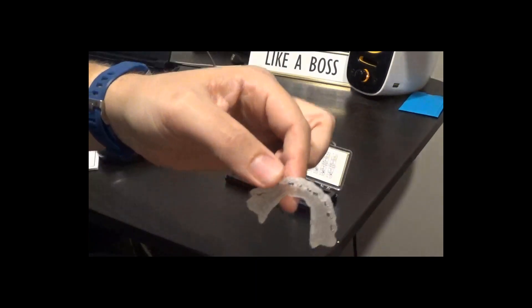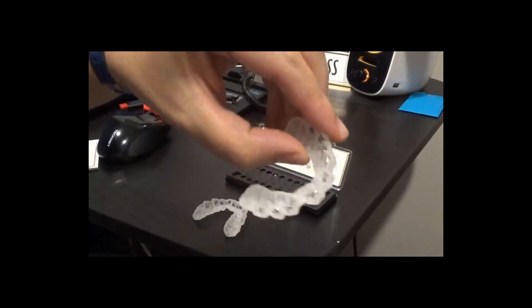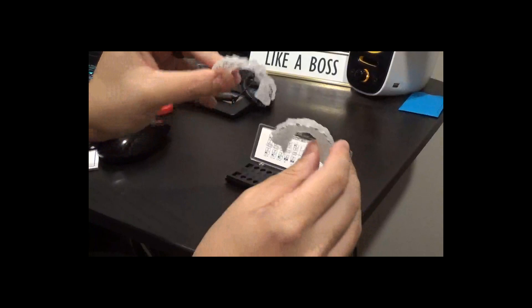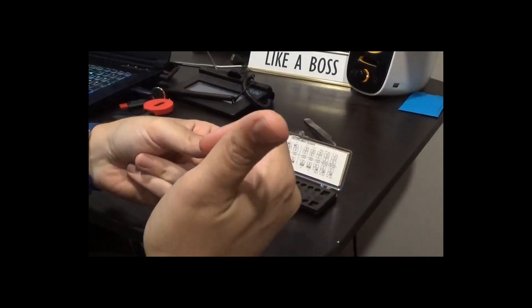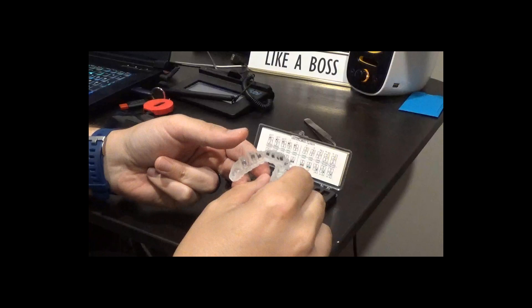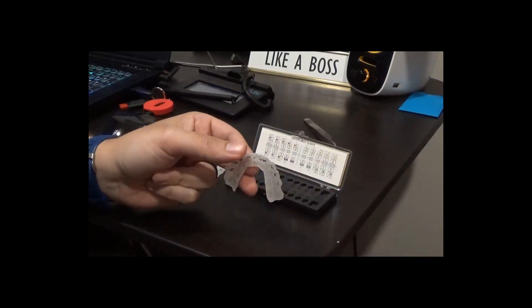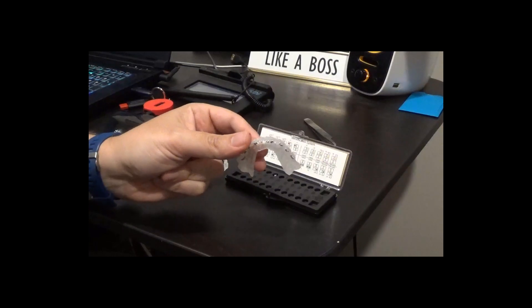Here's the lower tray all loaded up, and here's the upper tray all loaded up. You can see pretty good retention, so you shouldn't really have too many issues delivering these into the mouth. I will probably section these down the middle and turn them into quadrant trays — I just like seating a quadrant at a time better than full mouth because it helps with isolation. I'll take a sharp pair of scissors and divide these down the middle, so when you see the delivery, you'll see these sectioned into two quadrants.